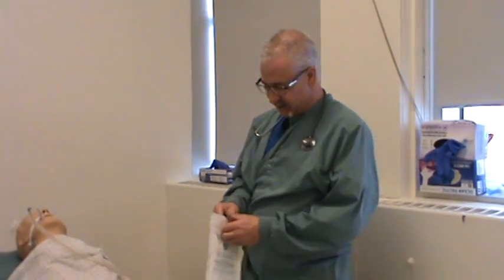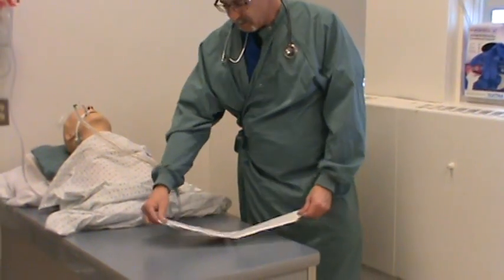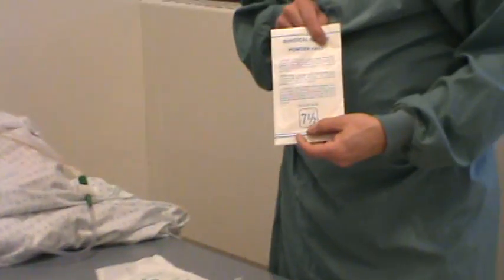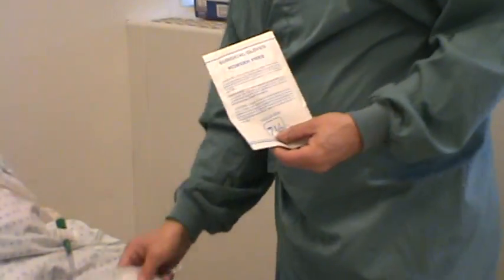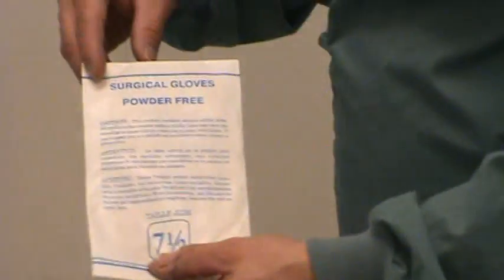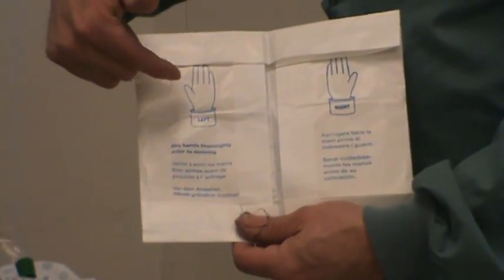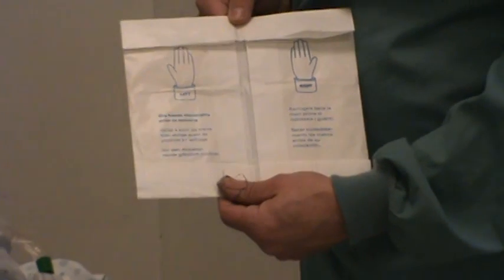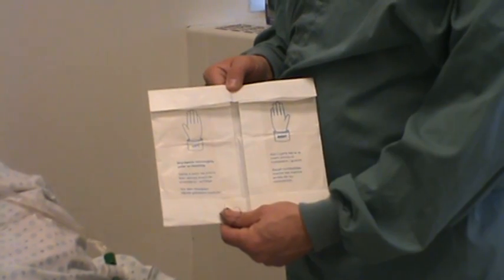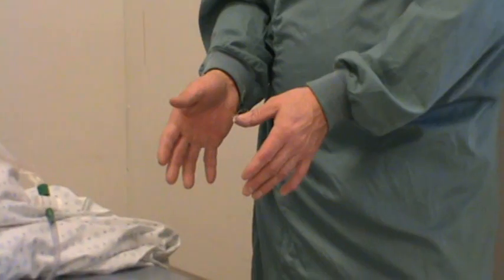Here's my package of sterile gloves. I'll open them up. They're still sterile inside the package. You can see it still says 7.5. When I put them on, the first thing I'm going to do is open them up. As soon as you open them up, you see it says left and right. Left is for the left hand, right is for the right hand. Place them down on a stable surface where they're not going to fall.